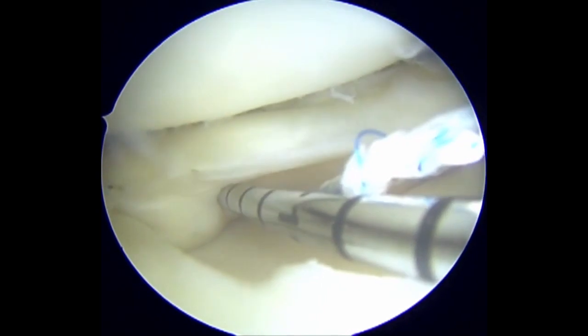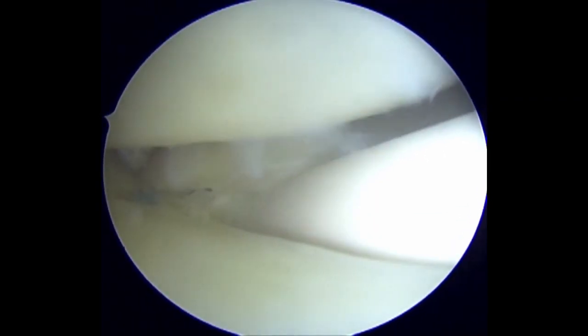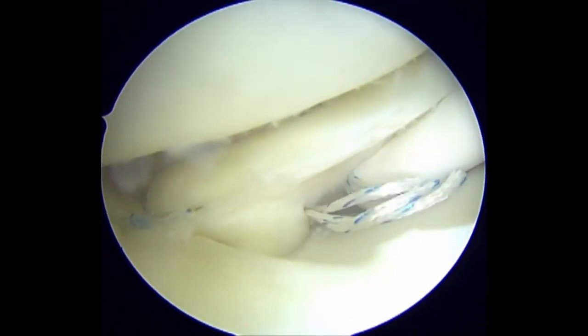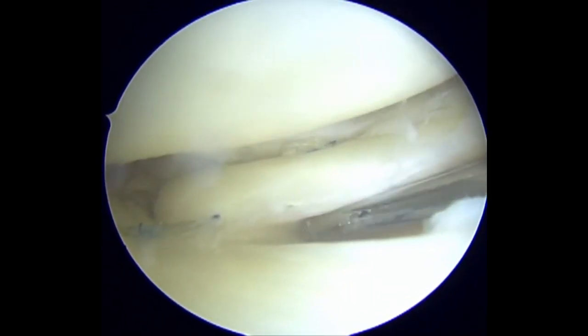A second horizontal rib stop stitch is placed at the inferior surface of the posterior horn. This serves to prevent flap re-displacement and to protect the radial tear repair by reducing the tension across the radial repair.